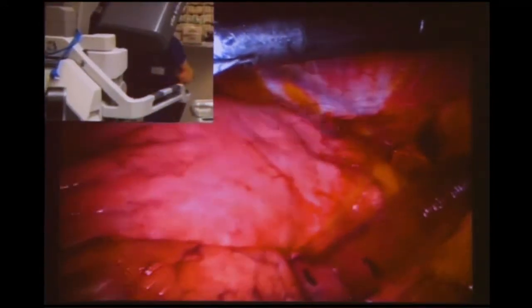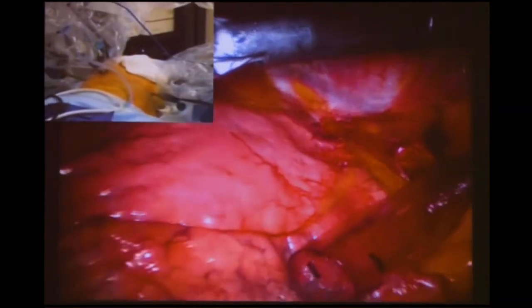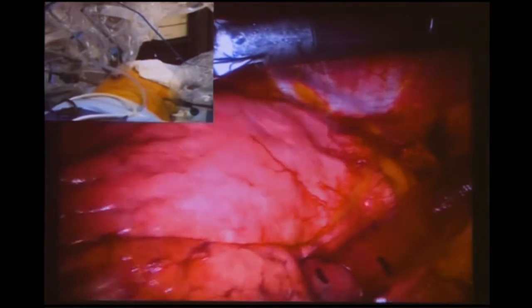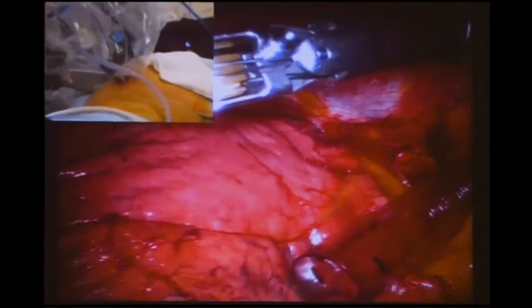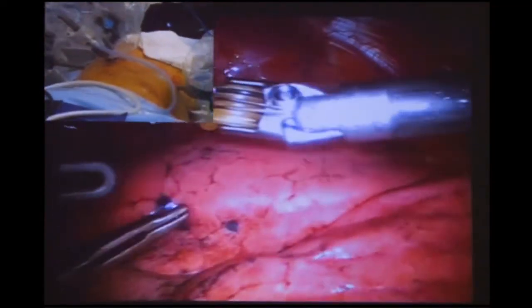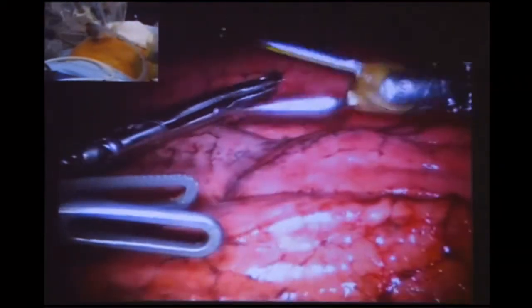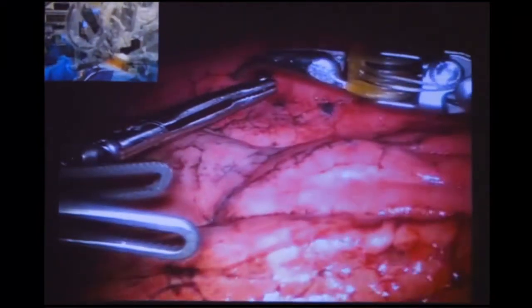We've docked very nicely, got the arms in, there are no adhesions, and there's a good fissure. I'm ready to go when you're ready. Just checking for a focusing issue — that's looking pretty good. The vision is okay. Can we set up the bipolar at 70? Thanks.